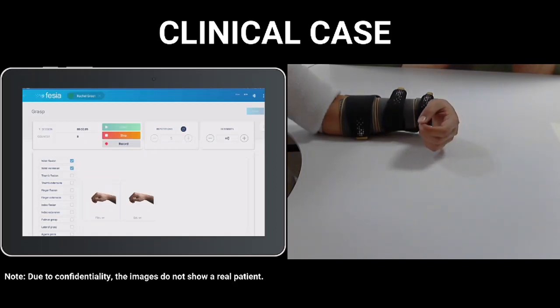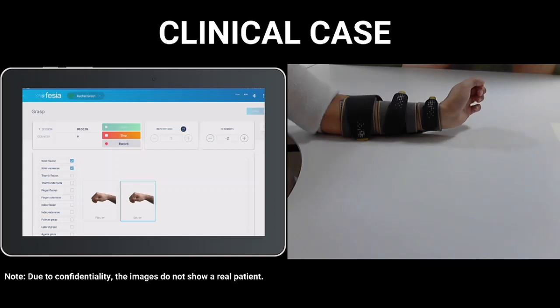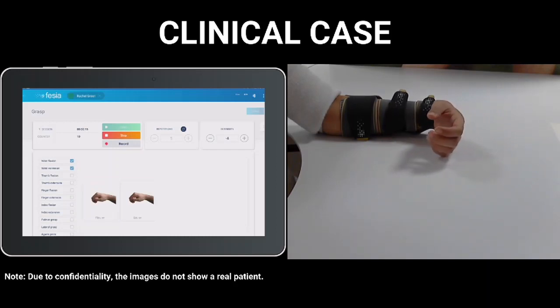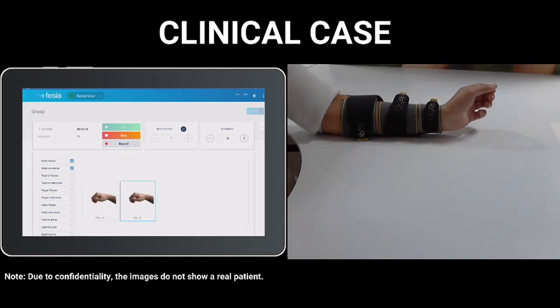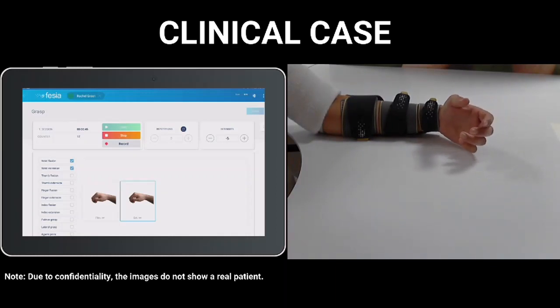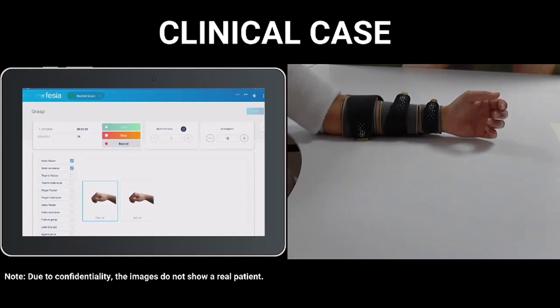And as you can see in the Fesia Pro application, I am going to decrease the intensity from both movements so that the voluntary contraction is higher and the component of contraction done by the stimulator is going to be not so important. Perfect. Now she's below the motor threshold. I know her motor threshold, and I know now most of the movement is being produced voluntary.